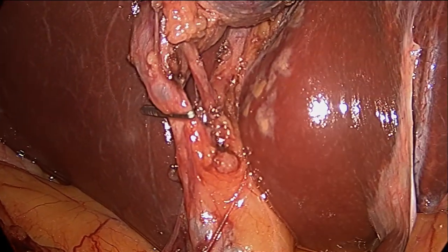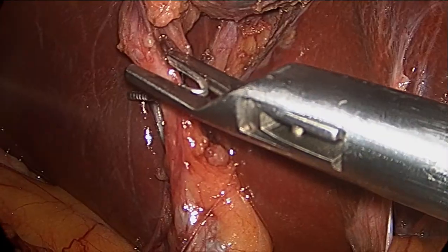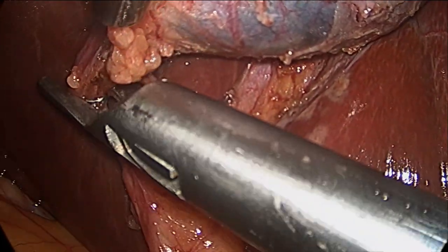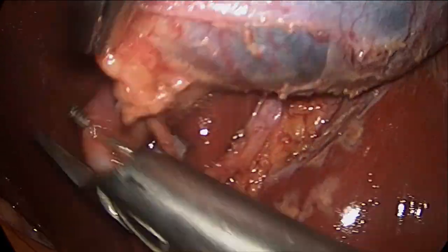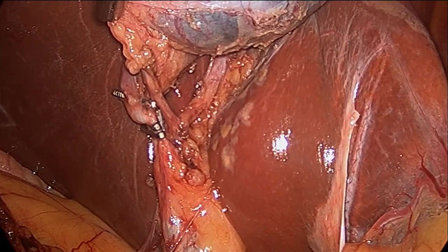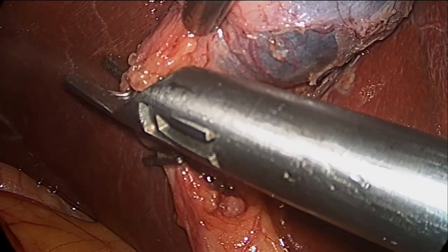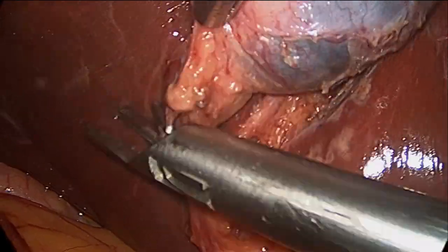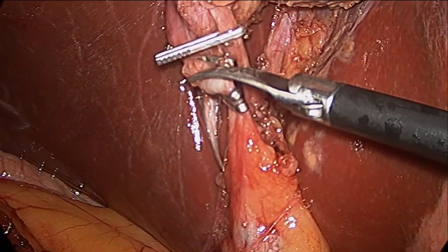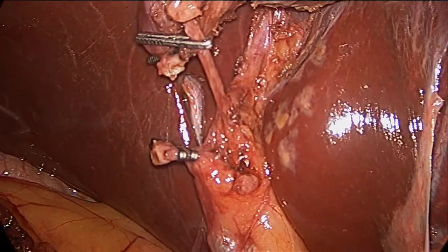Once this dissection has exhausted itself, I clip the duct of the gallbladder and I clip the gallbladder artery — of course, I clip the gallbladder artery only after leaving the artery that goes to the gate of the liver. After clipping, I divide the duct and artery of the gallbladder and continue to separate the gallbladder from the liver, tracing the artery.